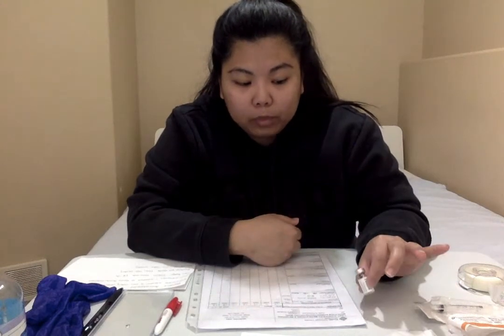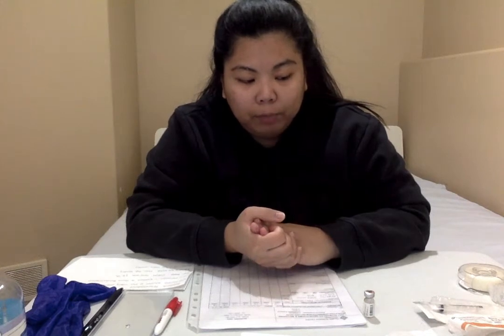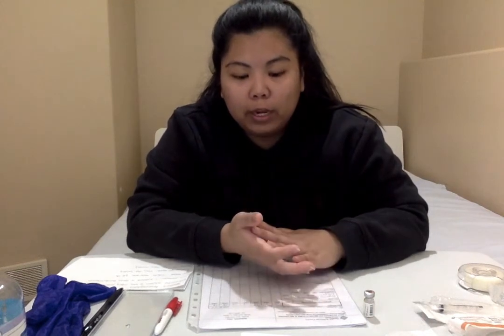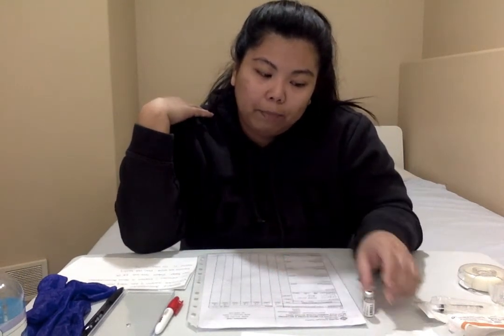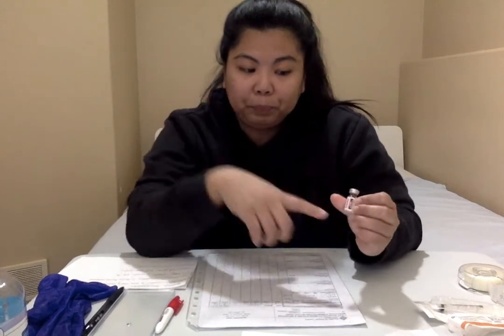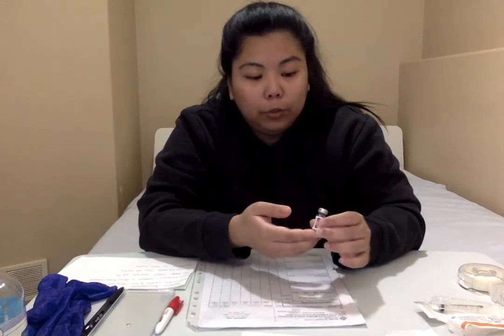And for subcutaneous route, the volume of medication we're allowed to give is between 0.5 to 1 ml. So we're still good. The volume is appropriate for subcut injections. And then for the locations of where we want to inject, we can either choose the abdomen or our patient's posterior arm. We can choose the thigh or the scapula. But for this medication, it is recommended that we administer it to our patient's abdomen. So that's what we'll do.